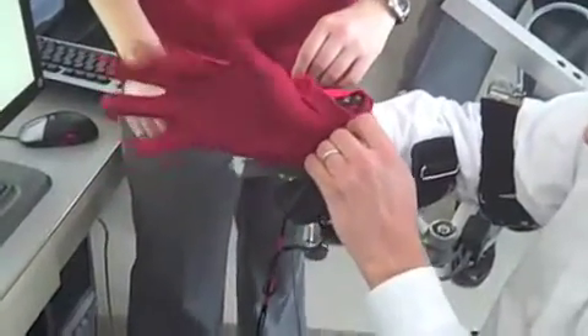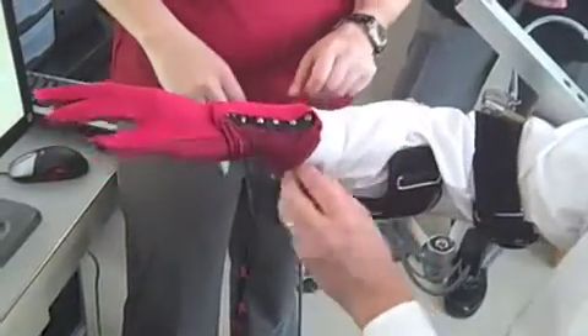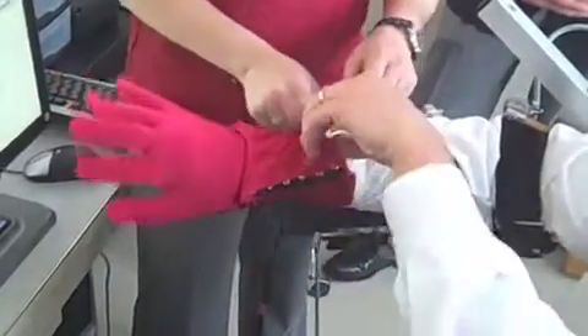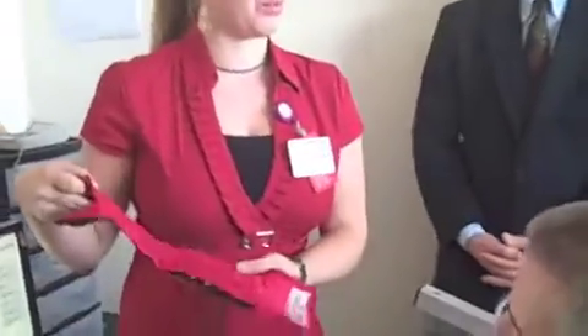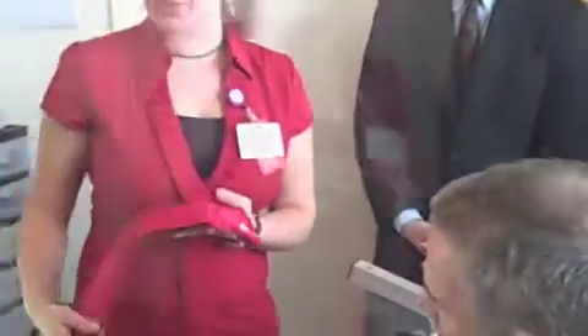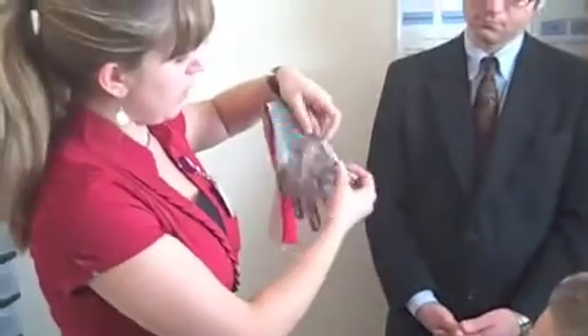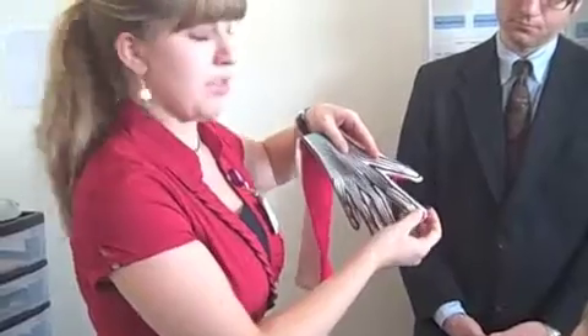MassTLC's robotics cluster explores the intersection between robotics, video games, and healthcare during a recent visit to Spaulding Rehabilitation Hospital. A wearable glove was developed by a group in Pisa, Italy, and we are lucky to have it here and use it. You can see this line that goes around the edge of the fingers — this is the actual sensor.